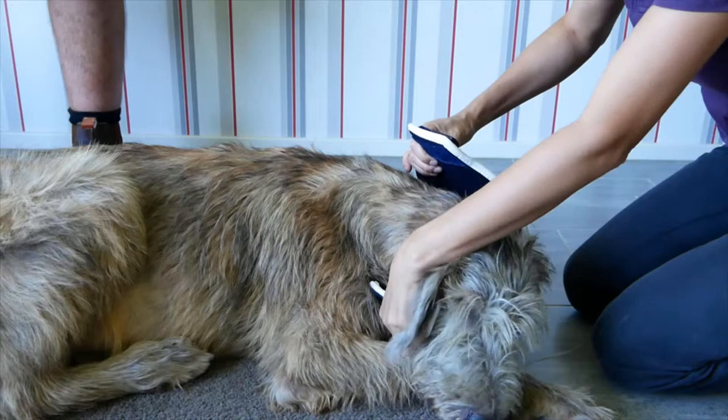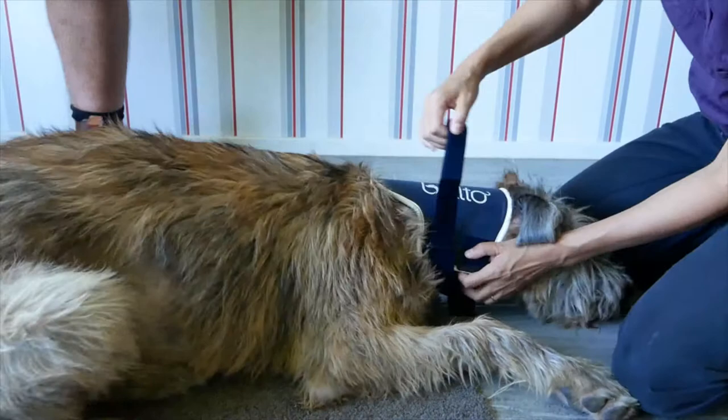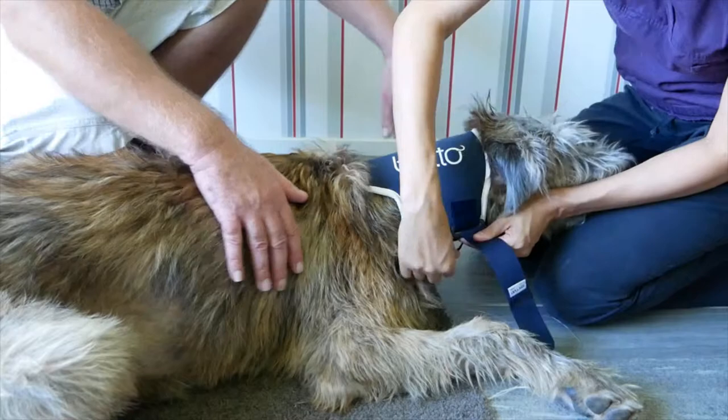To fit the brace, first close the body of the brace with velcro. The simple presence of the brace around the neck will impair the movement of the neck. There is no need to tighten too much. Then gently place the straps around the brace. Remember that your dog is injured, so be gentle with the movement imposed while fitting the brace.